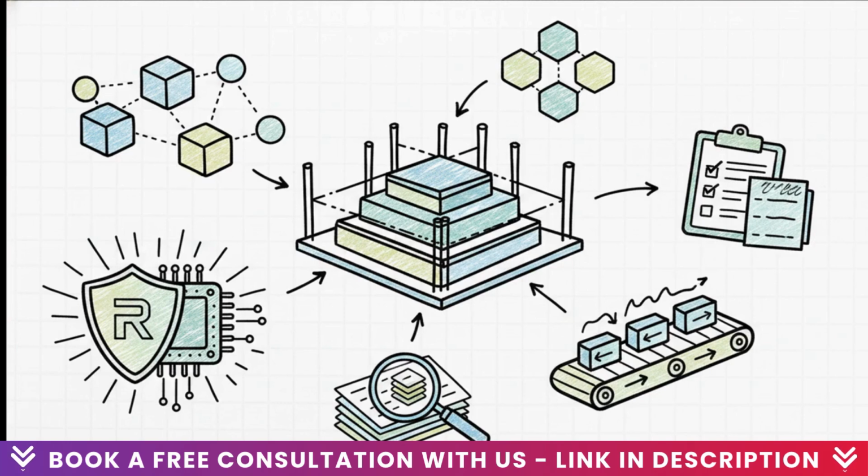To handle incredibly high spatial resolution DICOM formats and massive traffic, you need serious modern tools. Things like Kubernetes and Ceph, which distribute loads and redundant storage seamlessly across multiple nodes, giving you incredible elasticity. Under the hood, using a memory-safe language like Rust, alongside Red Panda for asynchronous message queuing, lets you handle DICOM CStore SCP services and metadata extraction without even breaking a sweat. Toss in Postgres as your primary index for patient and study metadata, and Apache Doris for logging, and boom, you've got a powerhouse system designed for global scale.